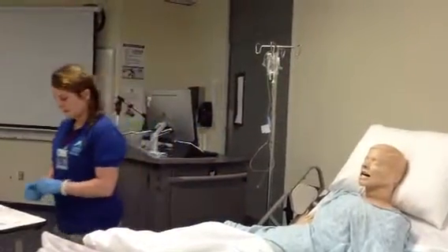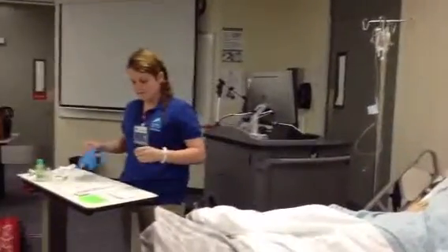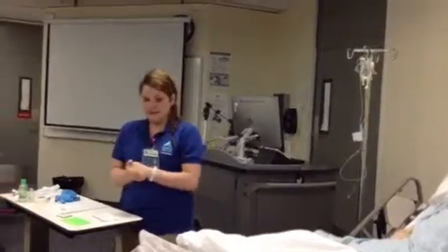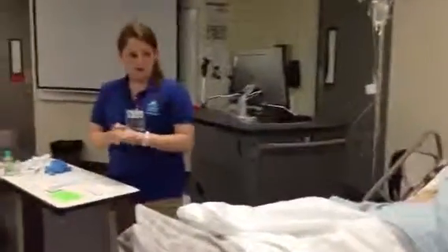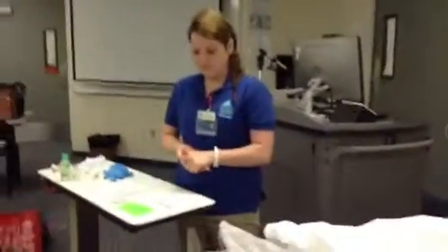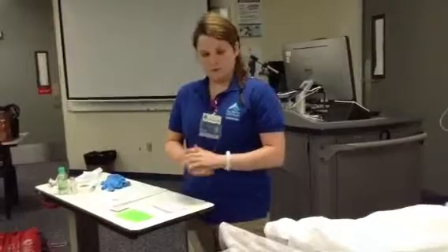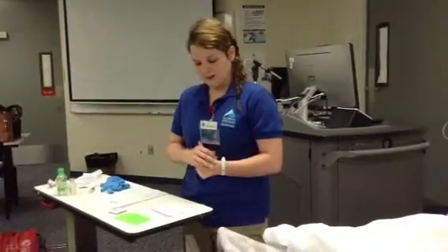So I would document that I used my MAR to verify the medication. At 0300, the vancomycin 500 milligrams was given peripherally. No phlebitis was seen, no redness, swelling or inflammation at the IV site, or infiltration. 50 milliliters of saline used to deliver med in mini bag.